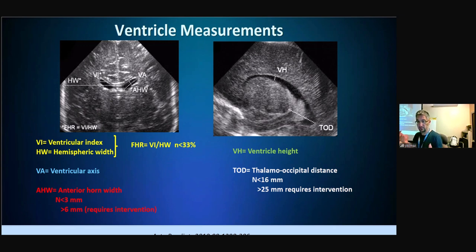So for this purpose, there are some measurement techniques. Whatever you do, there are many options. Whatever you do, you should always use the same measurement so that you can do an appropriate follow-up. Here we use anterior horn width, AHW. So that's very accurate, very reproducible.